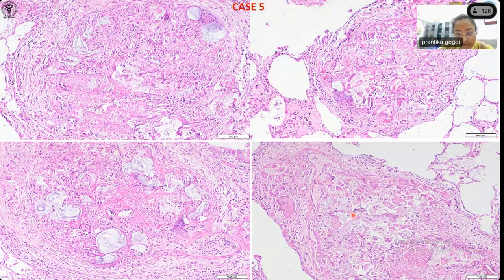Blood vessels. The majority of these granulomas are present within the blood vessel lumen, causing luminal occlusion. Agree? Yes, sir. So what can you think? A 21-year-old male presented with multiple granulomas within the vessels, some of them in the interstitial location. They have a foreign material, some structures that are eliciting granulomatous inflammation. Can it be pulmonary embolism?